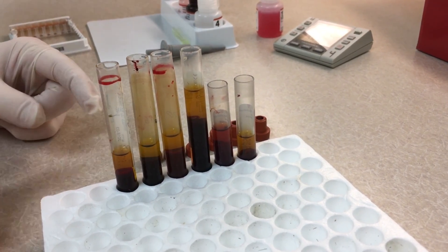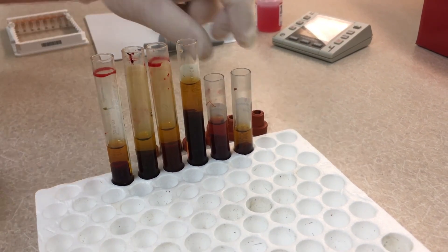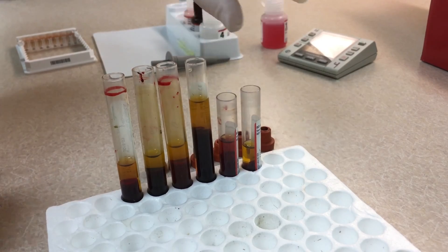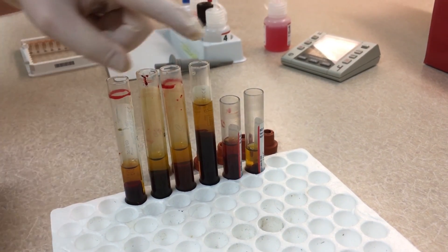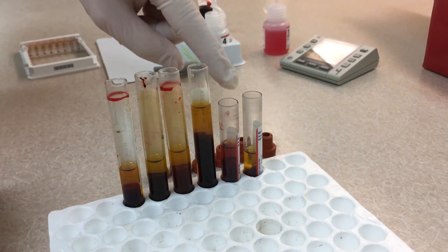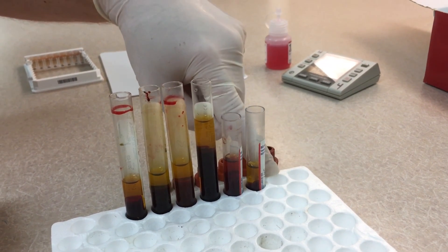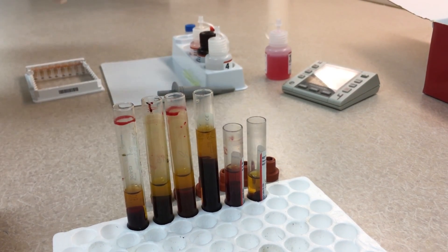A quick note on sample preparation: if you have some kind of holder that will hold your tubes straight up and down, it'll help let the serum run to the top. You want to leave some blanks at the top, and leave a spot for a positive and negative control, then your samples.